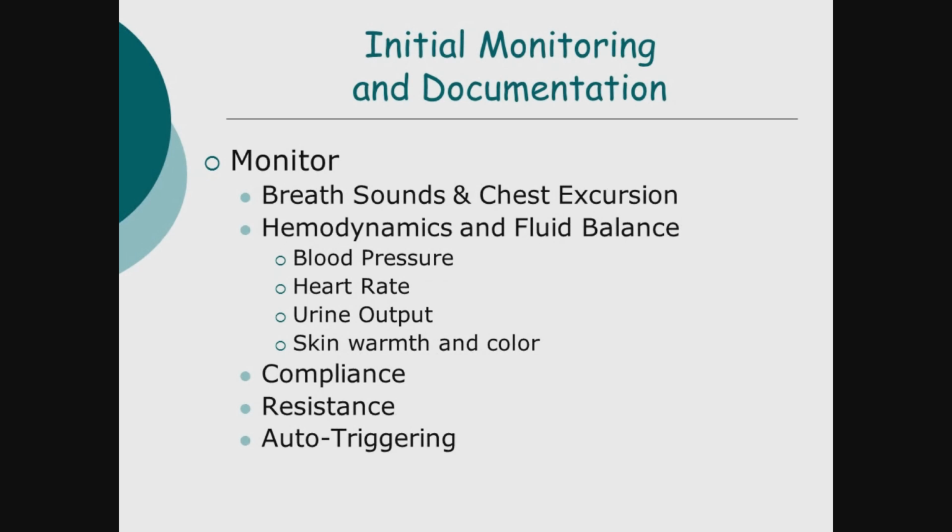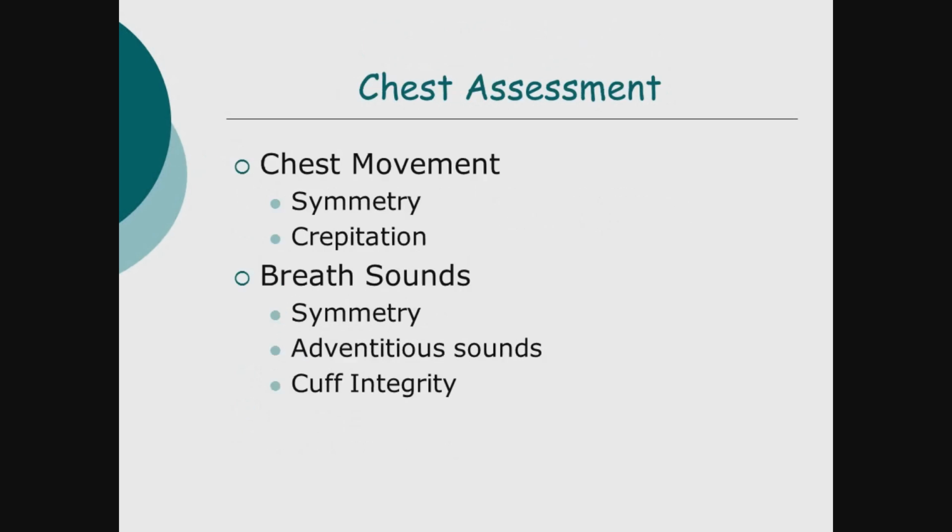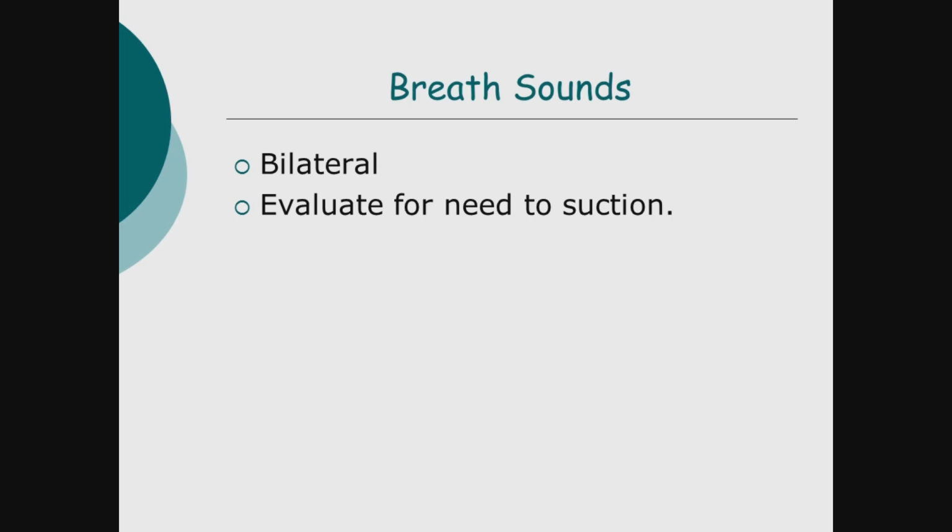So again, this is just looking at the initial assessment. Measuring compliance, resistance, and auto PEEP should be thrown in there also, and just verifying that the ventilator is set up correctly. As far as chest movement, want to make sure that it's symmetrical in nature and the breath sounds are symmetrical. Most of this is pretty common sense.